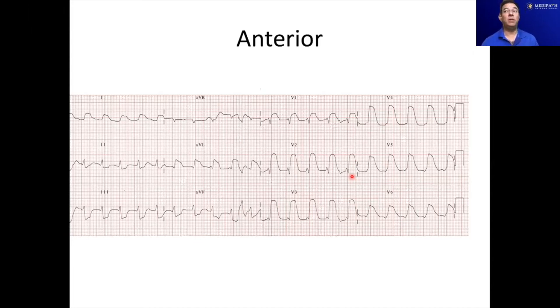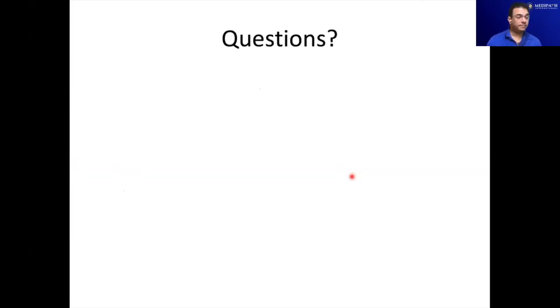So in review, what did we look at? We looked at typically what the electrical activity of the heart means, each part of the heart, the P wave being the atrial electrical activity, the QRS complex being the ventricular depolarization activity. We talked about some of the slow heart rates, 1st degree blocks, 2nd degree blocks, 3rd degree blocks. Then we talked about some fast heart rates and how to differentiate them in a short period of time, whether it's regular or irregular, and whether it's narrow or wide. It breaks up to 4 different boxes. Each of those 4 different boxes, if you just remember the 3 choices that you have to think about.